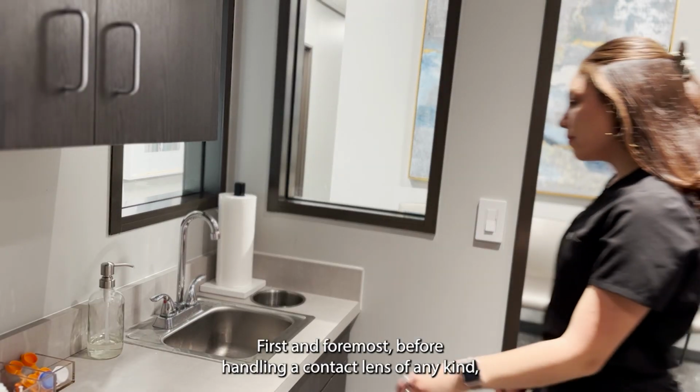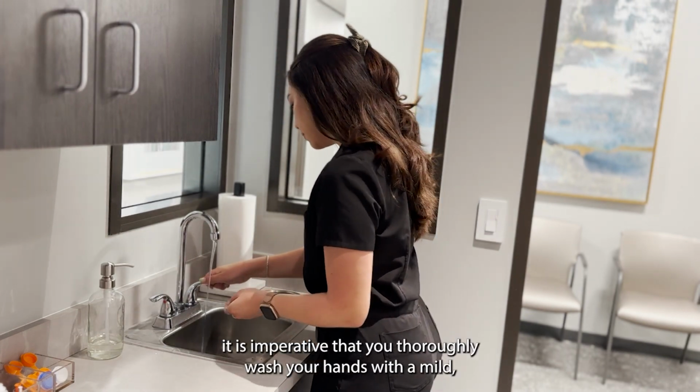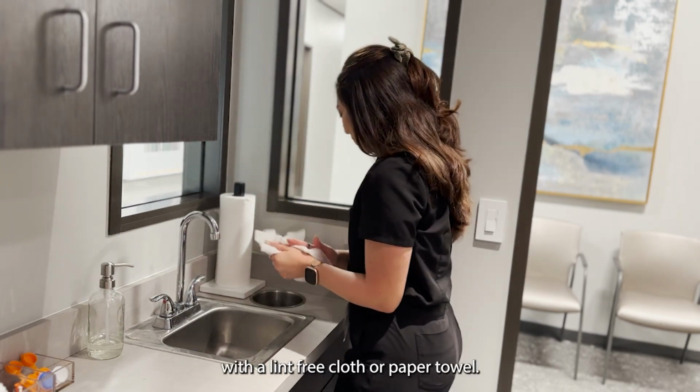First and foremost, before handling a contact lens of any kind, it is imperative that you thoroughly wash your hands with a mild, non-moisturizing soap, and then dry your hands with a lint-free cloth or paper towel.